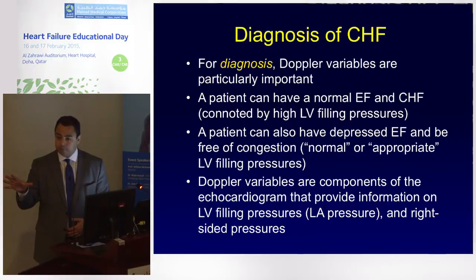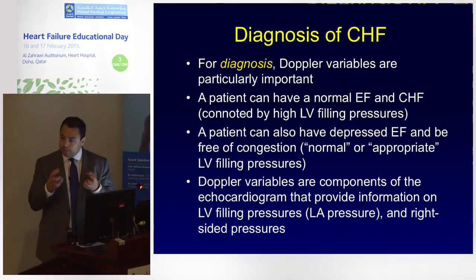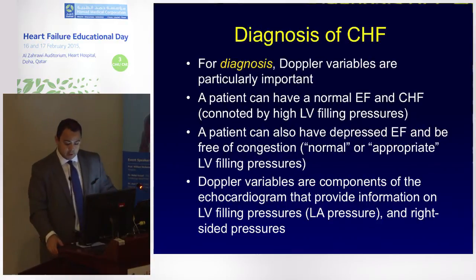you're in decompensated heart failure. That patient can have a pulmonary embolus, can have pneumonia, can have a COPD exacerbation, many other things. So we find Doppler extremely important in making sure that someone with a known cardiomyopathy actually has decompensation, rather than having a non-cardiac cause of dyspnea, which of course can occur like in anyone else, and probably some of them more often than in patients without cardiomyopathy.